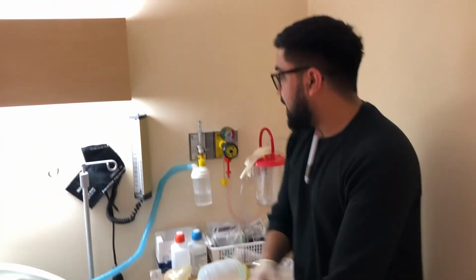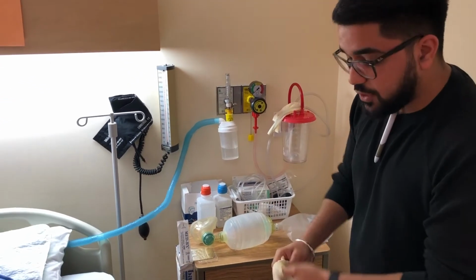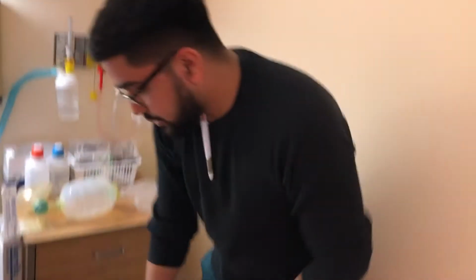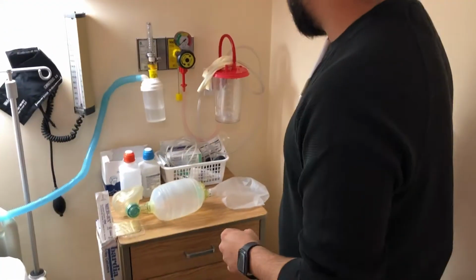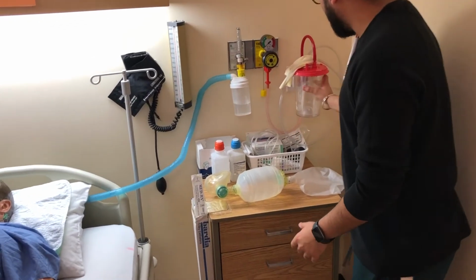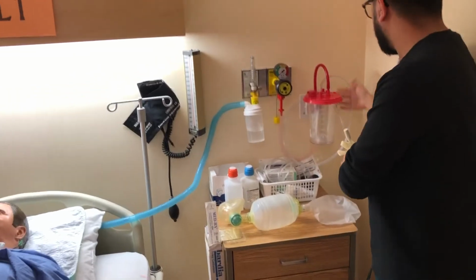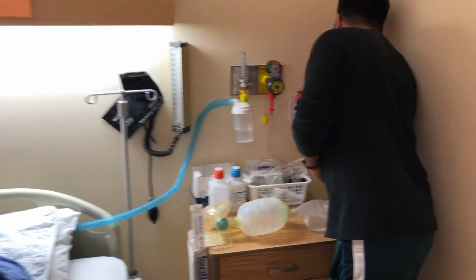What you want to start off with is doing a general check of the safety equipment. So you want to make sure all the equipment is connected. We have our suction here. We know that this is the tubing for it. It's connected here. We can turn it on.